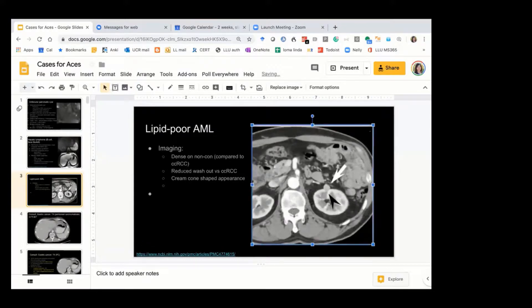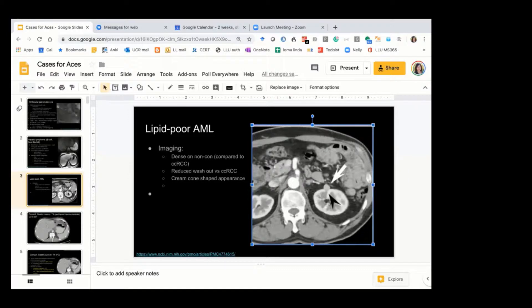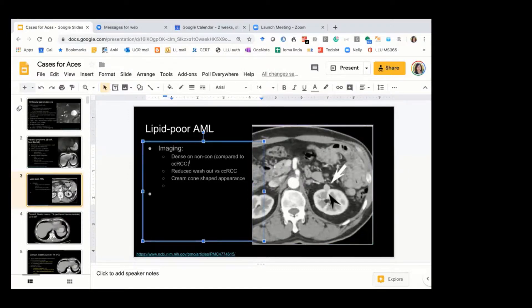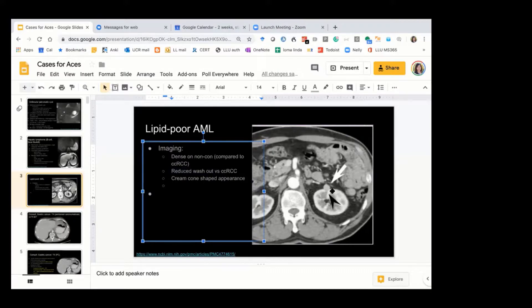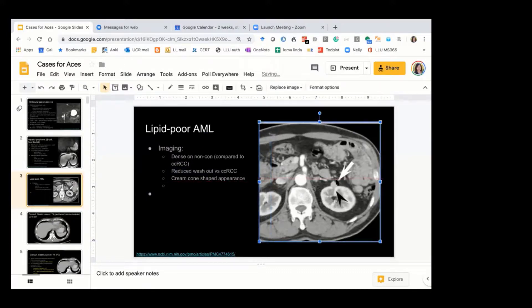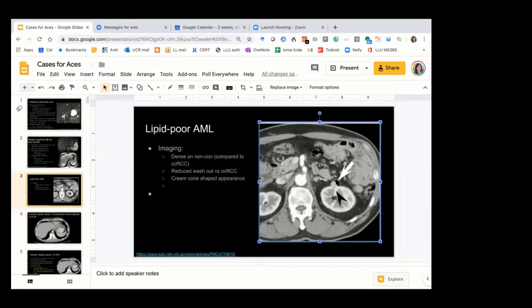Lipid-poor AMLs — I don't know how specific these signs are, but every time I've seen them it turns out to be AML. They are dense. Typically, the way you differentiate a lipid-poor AML from a clear cell is that on non-con they're dense, typically about 40 Hounsfield units compared to clear cell which is about 30. They apparently have reduced washout compared to clear cell, but that's harder to assess. And they have this ice cream cone-shaped appearance. On MR, because they're dense, they're T2 dark, like papillaries, but the wash-in wash-out is similar to clear cell.